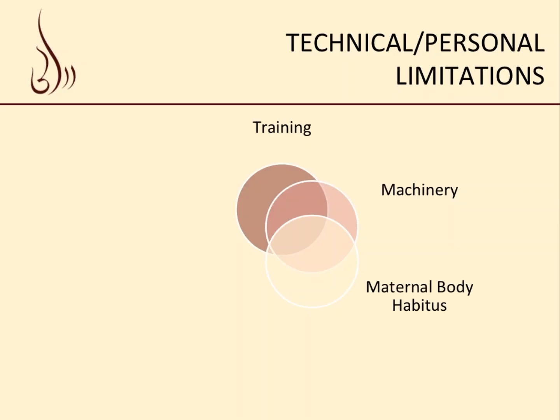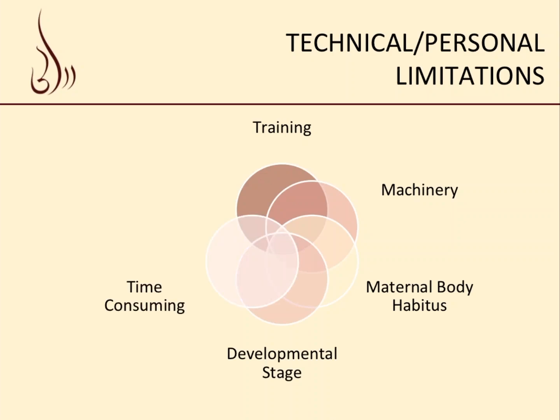And there's a recent publication from Dr. Letty Romero, I believe, in JAMA that was recently published to that end. The developmental stage of the fetus is very important to keep in mind because there are limitations early on. This is time consuming. Remember, I showed that the average time for a nuchal is 20 minutes, and when you are looking at various other markers, you will need added time. And we have to be very careful not to cause undue parental anxiety.